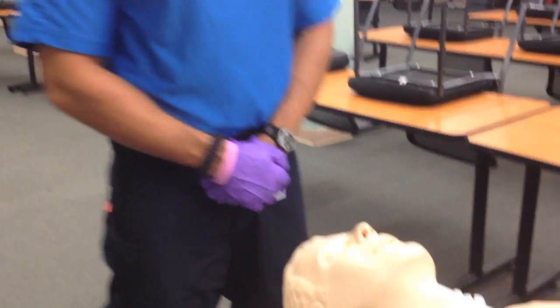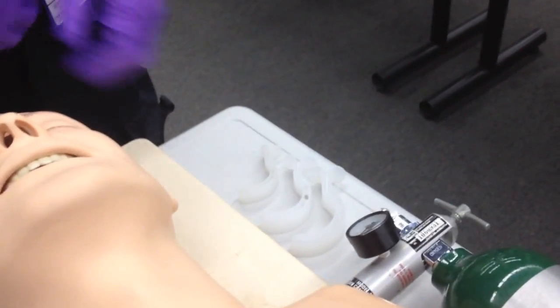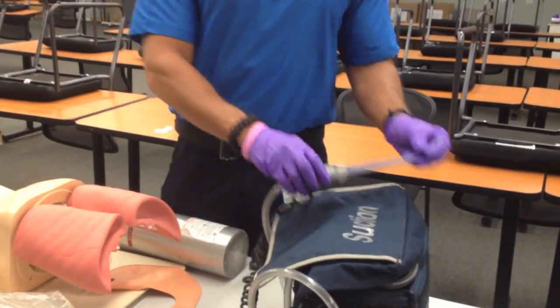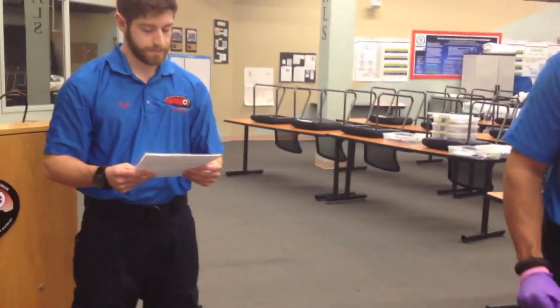Welcome to the BVM ventilation of an apneic adult patient station. You have already been given the candidate instructions and you now have two minutes to look over your equipment. I'm going to check over my equipment. I have an adult BVM, proper size OPAs, an oxygen bottle, and proper suction with my rigid tip catheter, which does turn on with manual suction. I think I am ready to begin.